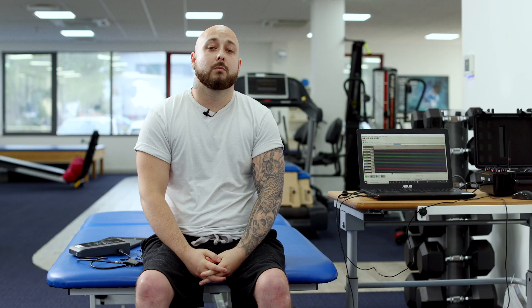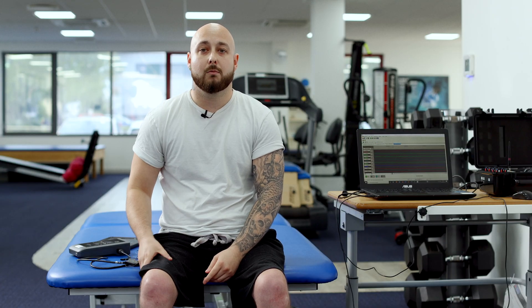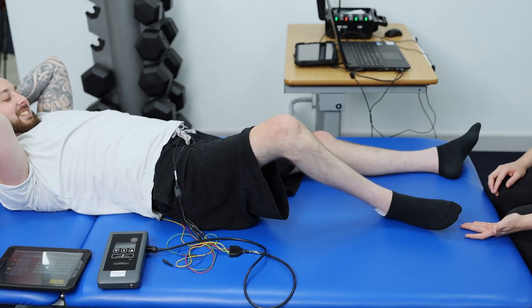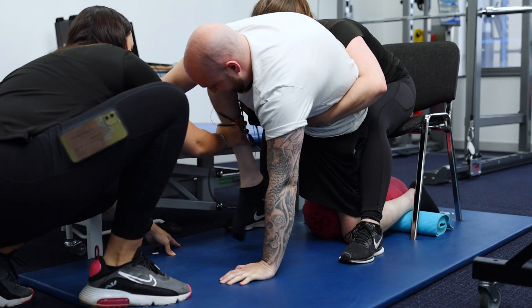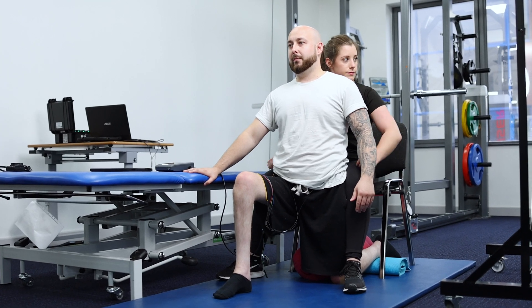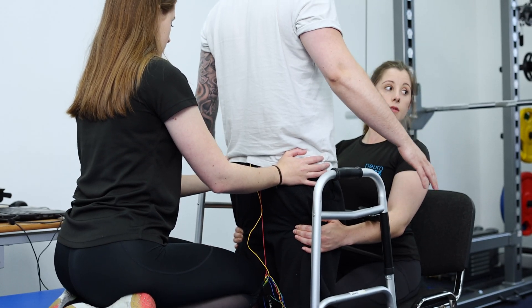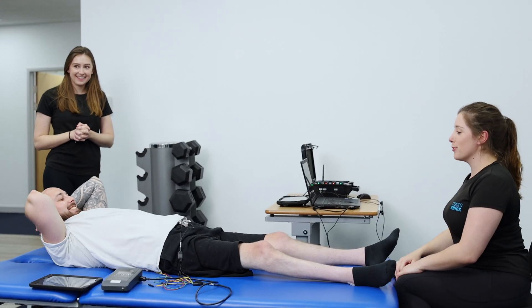The benefits I've had from using the stimulator include different muscle groups coming back in my leg — my right hamstrings, my hip flexors. I've also had bowel and bladder control come back, which when I was in hospital I was told was one of the last things that would come back. So it really surprised me that I managed to get that back quite early on. My hope from using the stimulator for myself and other people is just to give them an opportunity, a bit of hope, that trying something new can maybe change their lives and give them an extra boost that they might need.